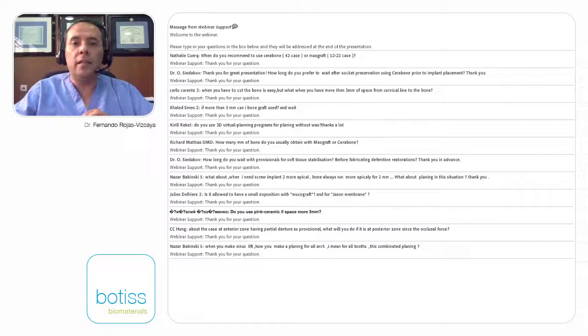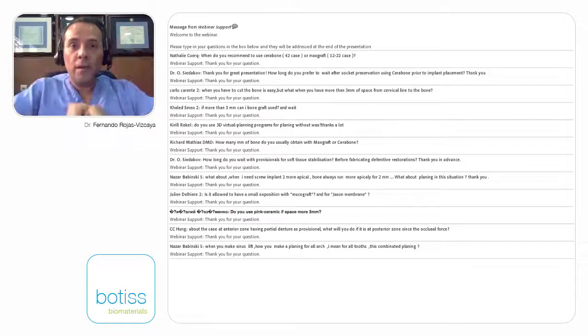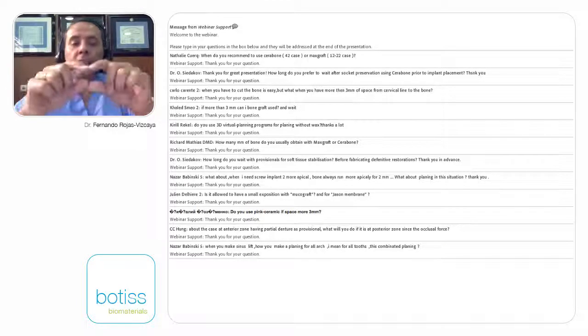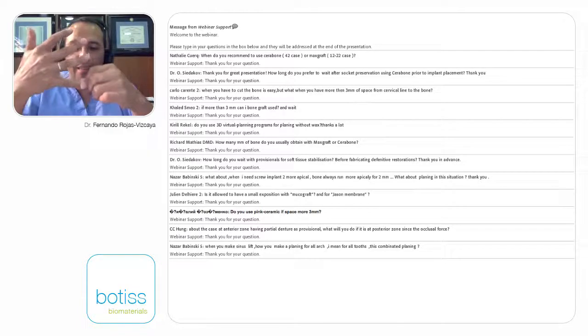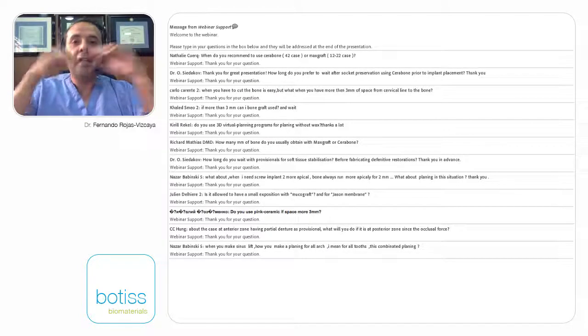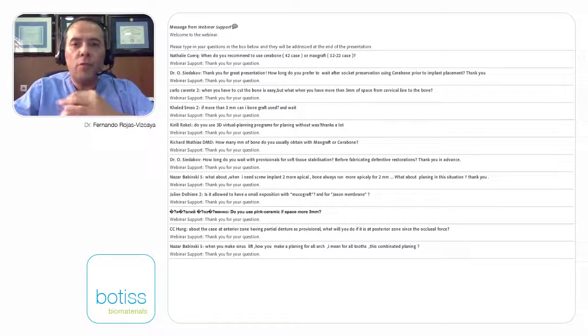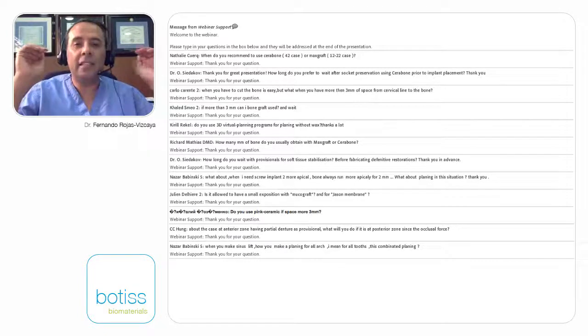This is speaking about single cases. If we are speaking about a full maxilla, we can see the case that the bone is at 3 millimeters, simple, implant at the level of the bone. But if the bone in some areas is more than 3, in other areas is at 2, and in other areas is less, and if you are planning to obtain a fixed restoration, fixed means in my case that the teeth come from the soft tissue. So in this case, if we have this difference, some areas at 3, some areas less than 3, some areas more than 3, in the area that I have less, I can cut the bone. In the area that I have more, I can graft. So you can review in one of my papers, I think 2011, about the most apical buccal bone level protocol. I have this case where I have the 3 situations, and in some areas graft, in some areas cut the bone, in some areas leave the bone.